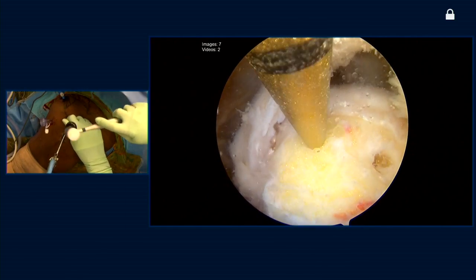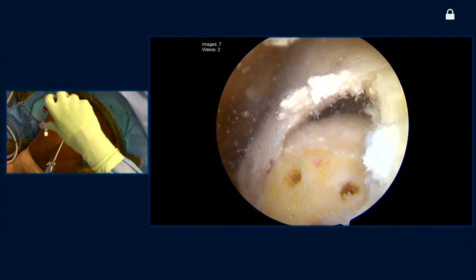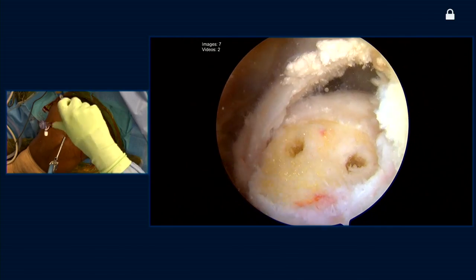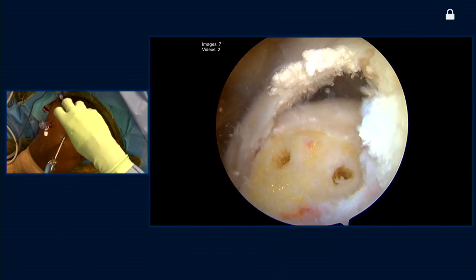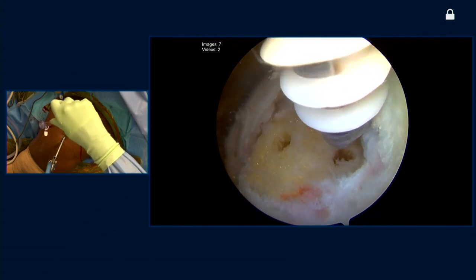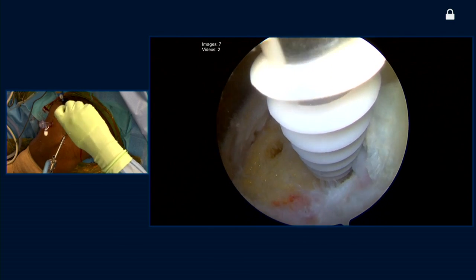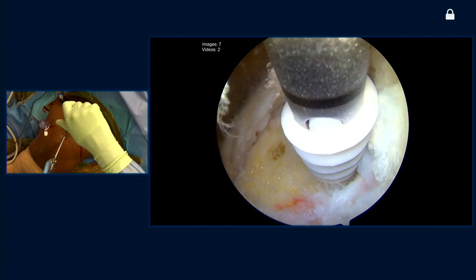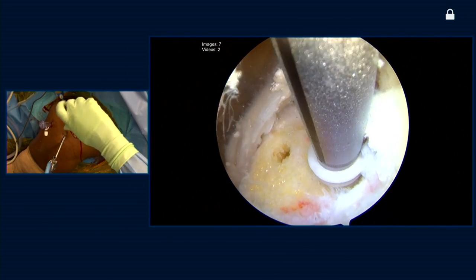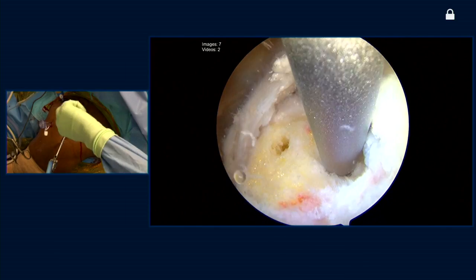So this is a 62-year-old lady — what if it was a 75-year-old lady? Do you have to do something different if the bone's osteoporotic? Well, there are a couple things. Number one is we can upsize our anchors — prepare the same size pilot hole but use a 5.5 or even a 6.5 anchor. In my experience, that's been sufficient to gain appropriate fixation. We obviously have taps for harder bone. In worst-case scenarios, you can actually use a screw similar to a biceps tenodesis screw and put suture or tape through it to get a firm bite. But fortunately, with contemporary anchor techniques, it's fairly uncommon to see failure at the anchor site versus failure at the suture-tendon interface.